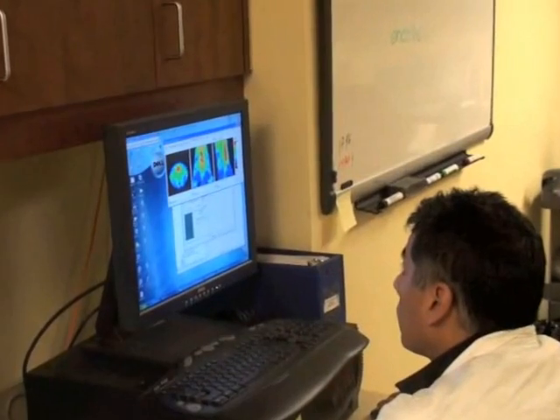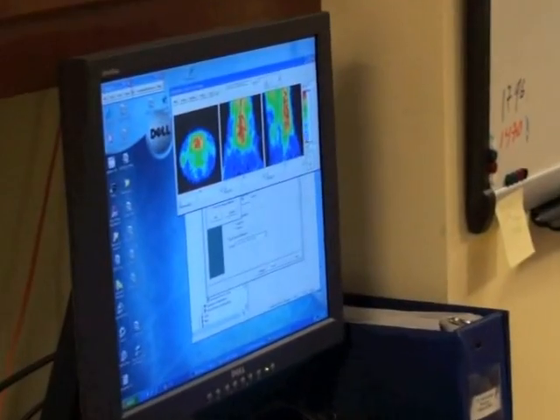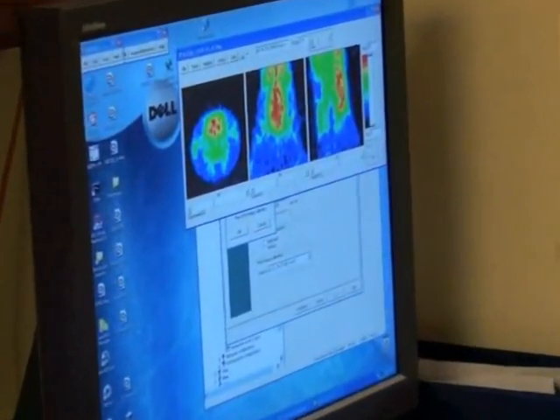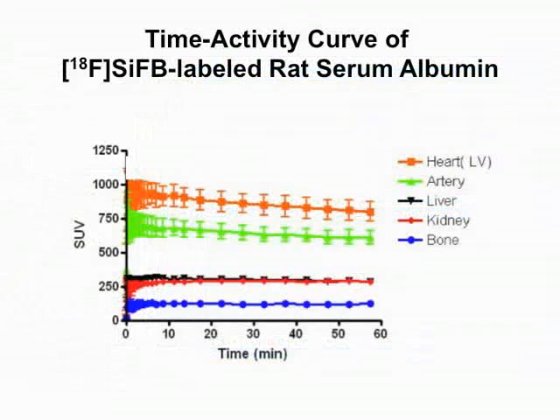Afterwards, reconstruct the PET image using two-dimensional filtered back projection to create a time series of three-dimensional images. Define volumes of interest within each time frame to determine the amount of activity in a specific region over a period of time. When plotted on a graph, these data can be used to derive kinetic and functional parameters.